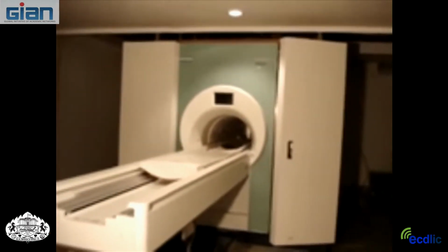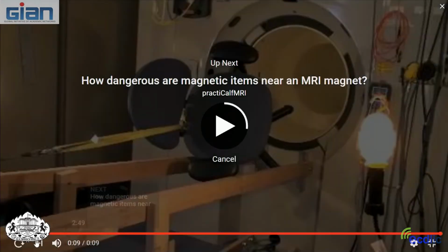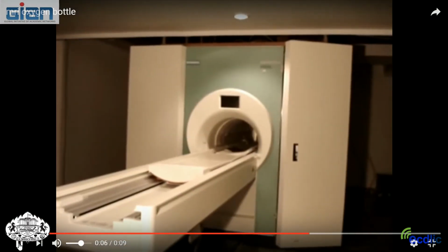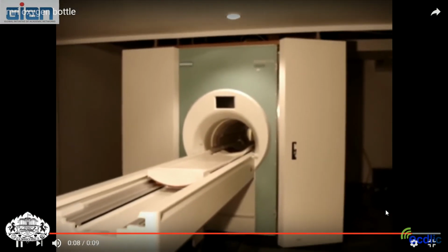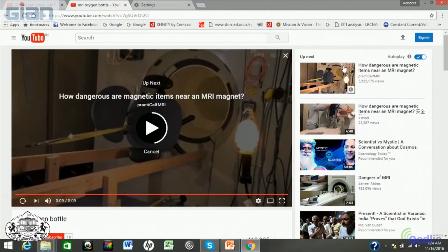That's an oxygen tank being pulled into the machine there. So you can see once it reaches a certain place in the field, it's very quickly pulled in. So you can see how dangerous this can be when you get objects in there.